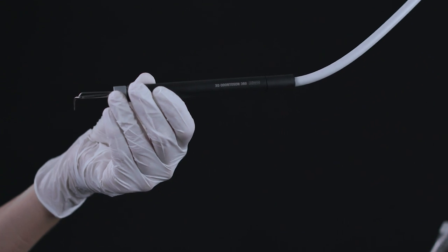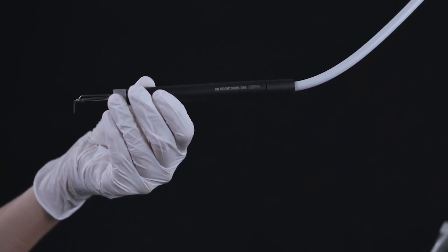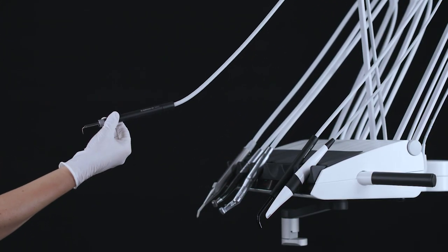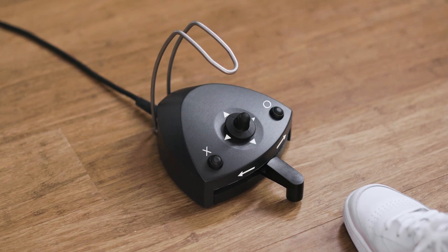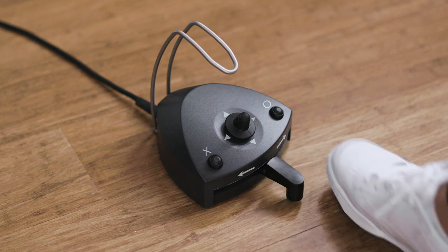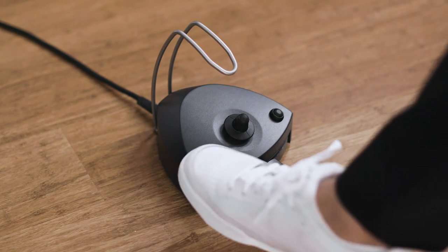The XO Odontoson 360 is a multipurpose dental scaler for periodontology, endodontics, and prophylaxis. Lift the scaler forward and control it with the foot control. Switch on the power by moving the pedal right or left. You can see the power on the display, shown in percentage of maximum. Enable or disable the irrigation water by tapping on the left button X.